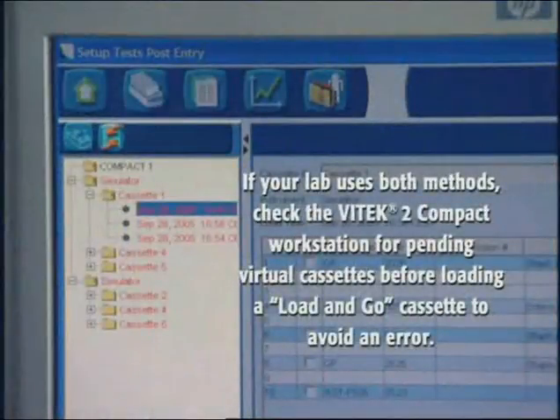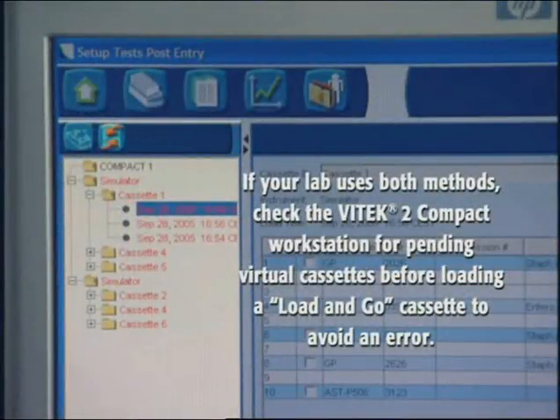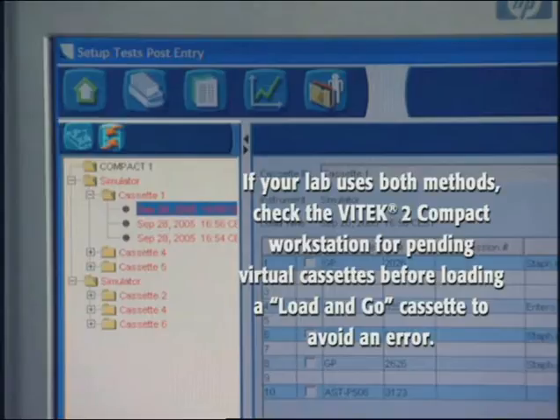If your lab uses both load methods, check the Vitek II Compact workstation for pending virtual cassettes before loading a load and go cassette to avoid an error.